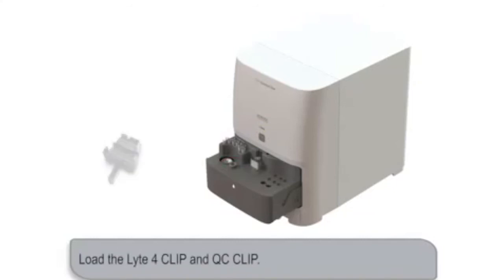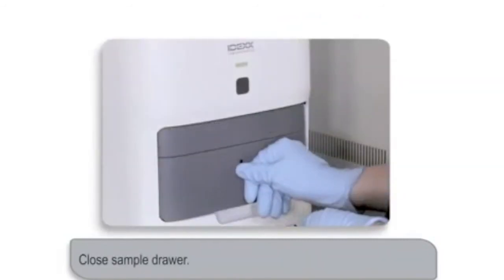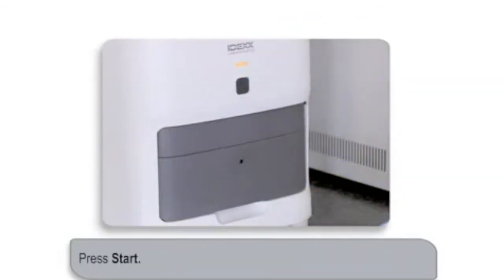Load the Lyte 4 clip first, and then the QC clip in the slide holder. Close the sample drawer, and then press the Start button.